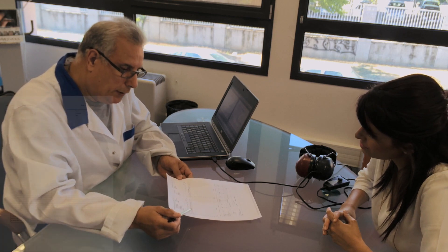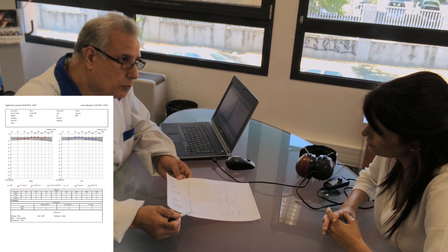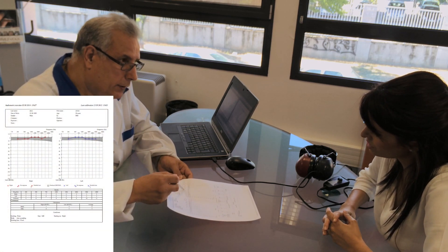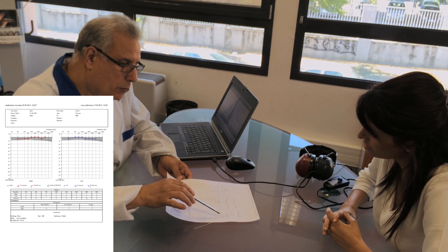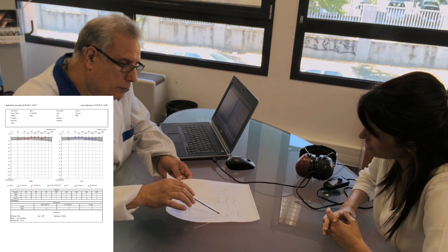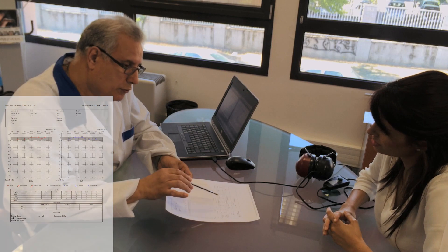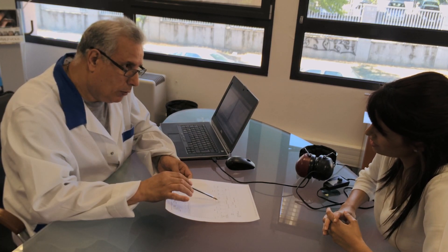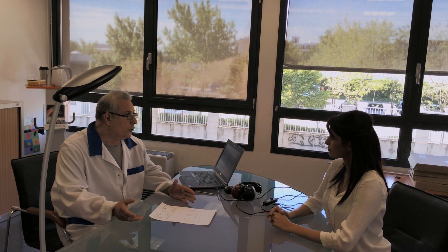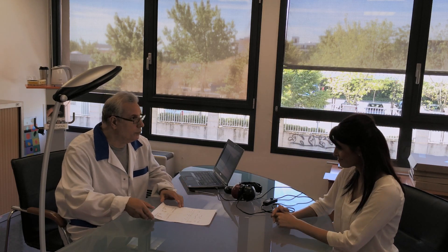At the end of the test, a report may be printed, including patient and doctor information, left and right ear result curves, predicted values, all the frequencies tested, and the chosen calculations used for predicted values. The operator may also add comments on the test or the patient.